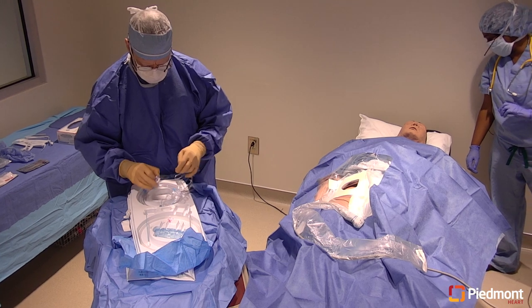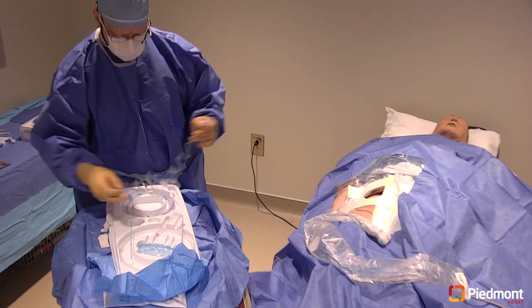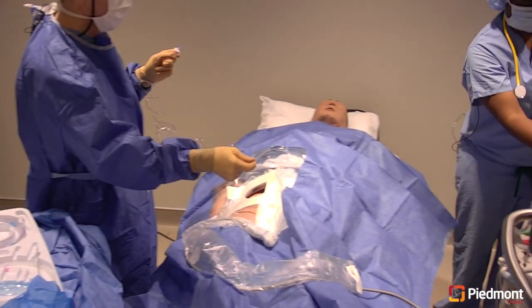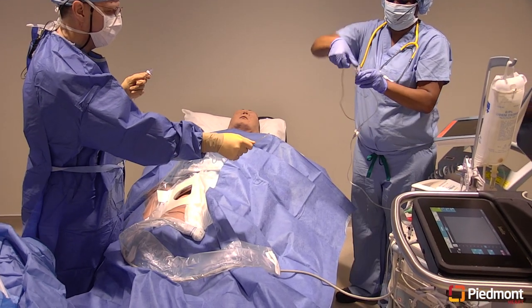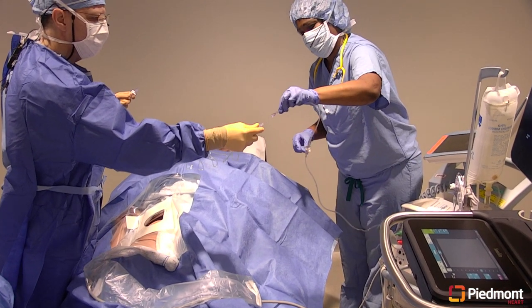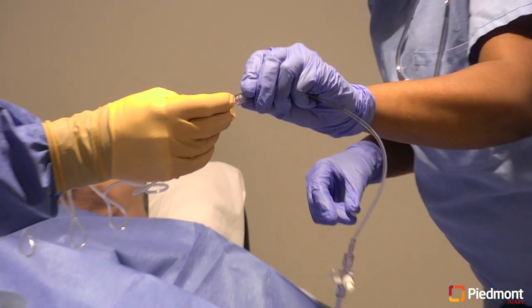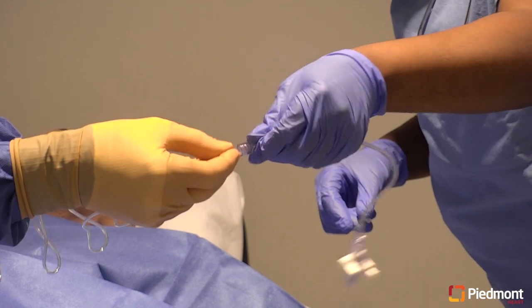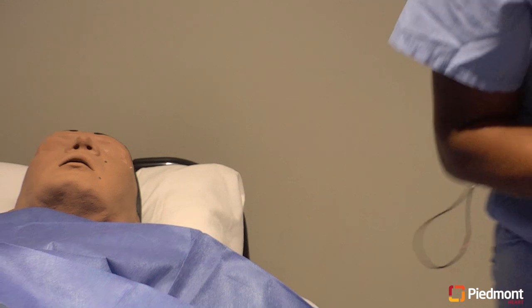Mr. Smith, are you doing okay? All right, we're just prepping. Okay, can I give you your flush line? It is now time to connect the pressure tubing. This is where it comes in key that you hung your tubing accessible. Do not touch the sterile part of the provider's tubing for the balloon pressure tubing.